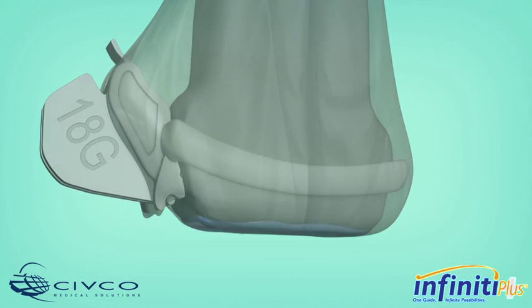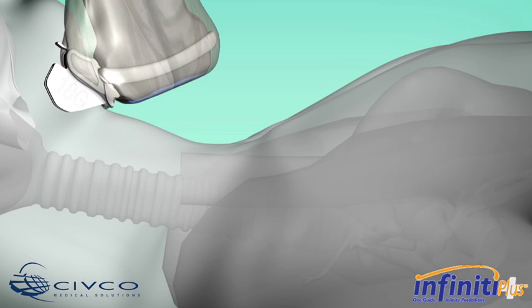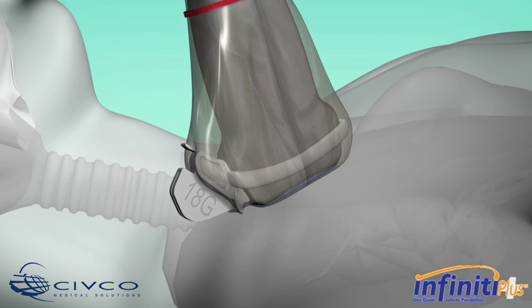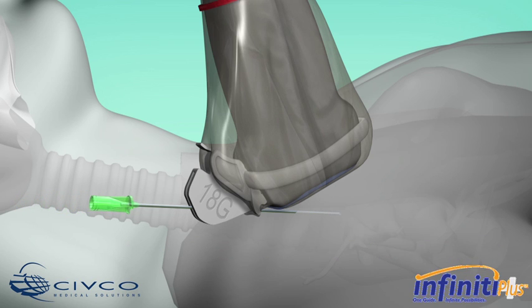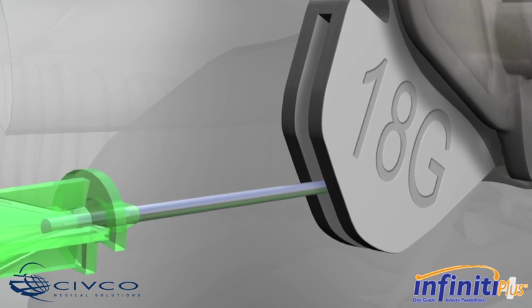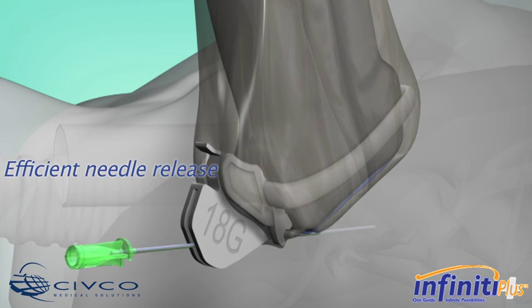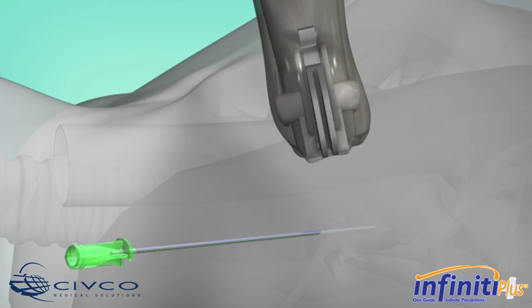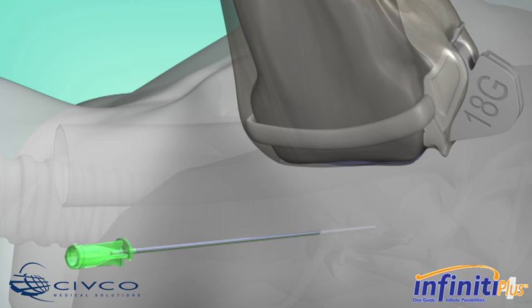Place the transducer and needle guide assembly in the proper location to reach the targeted anatomy. Then insert the needle into the open channel of the needle guide. Infinity Plus guides the needle in plane as it is advanced, providing smooth insertion while allowing you to see what you puncture. The open channel design allows users an efficient needle release for viewing the anatomy in both the short and long axis.